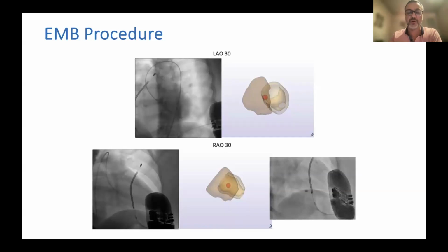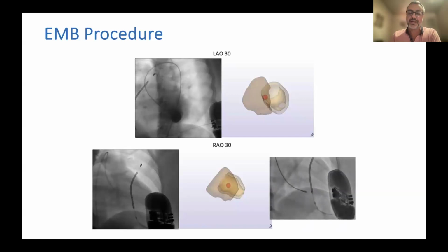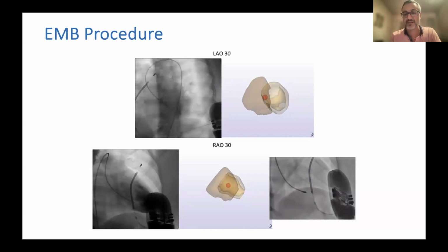First, at the beginning, you perform a ventriculography with different views. And with these views, you can identify the morphology and the geometry of the heart. It's possible before the intervention to choose the access route, for example right access or left access with different devices.